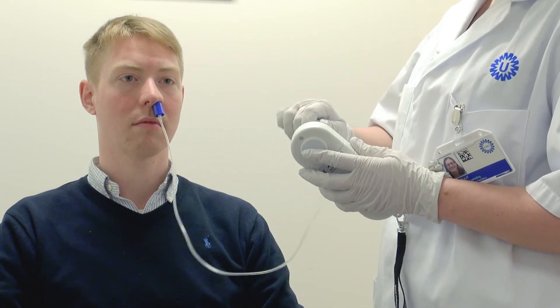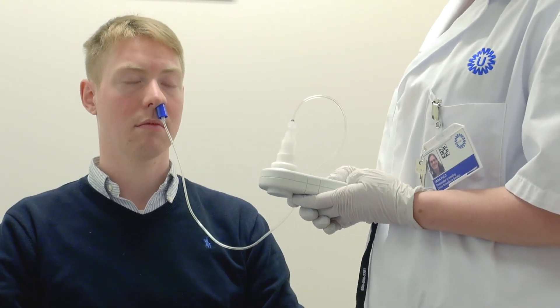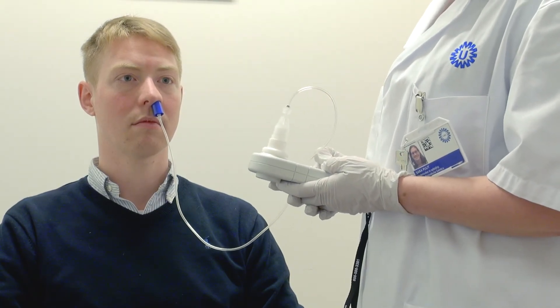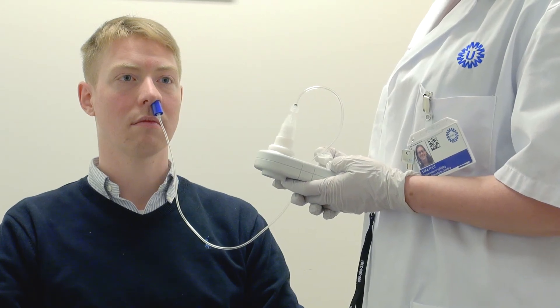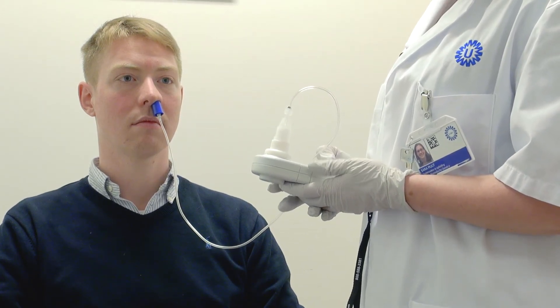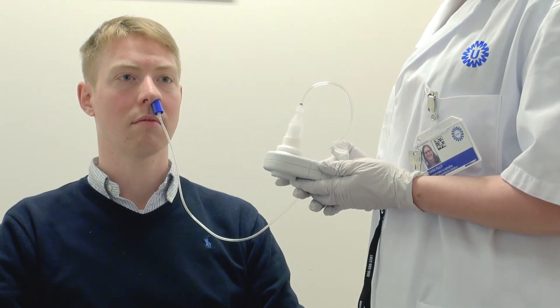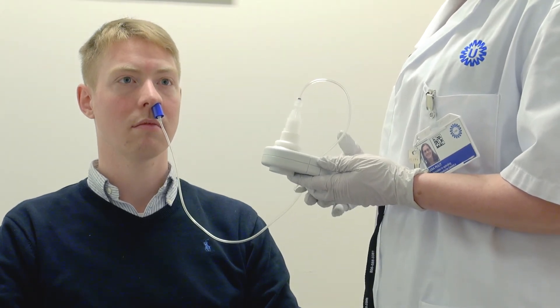I'm now going to attach the probe to the device. I'm going to turn the device on to SNP. The device is now ready. On the count of three, I want you to take a short, sharp sniff inhale. You need to keep your mouth closed.